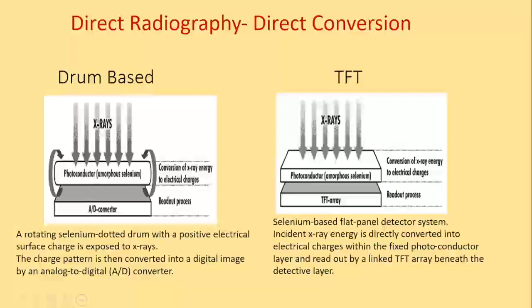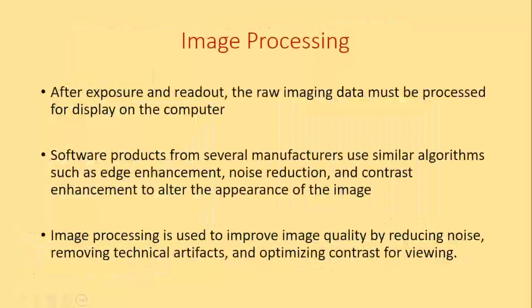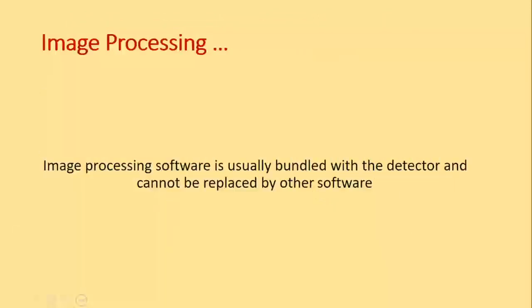So when you talk about CR, it has phosphor plates; when you talk RVGs, they're mostly with CCDs. And finally, when you're talking about CBCTs, you're talking about thin film transistors along with a photoconductor. That's the whole way it plays out. So when you use these photoconductors with thin film transistors, or TFT arrays, that's what a CBCT machine has, the FPDs, the flat panel detectors.